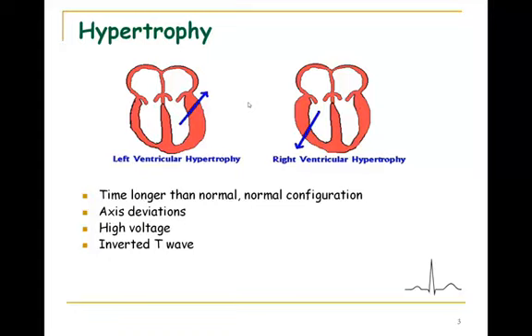the part of the muscle that was the first to depolarize will come out of its refractory period and then be the first to repolarize, and you'll see the T wave in the opposite direction of the QRS complex. In particular, in this case, would be, say, the R wave. You don't necessarily see that as much with right ventricular hypertrophy.